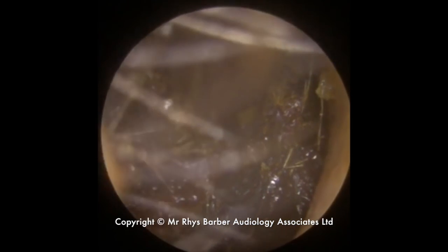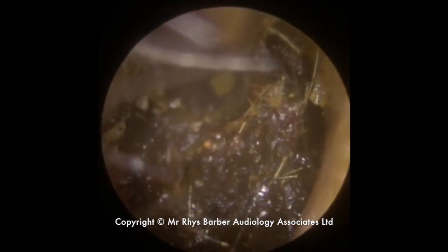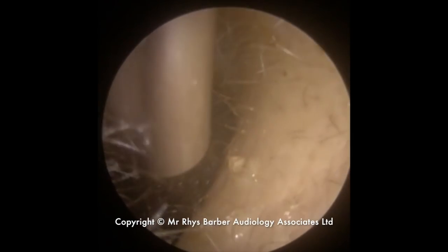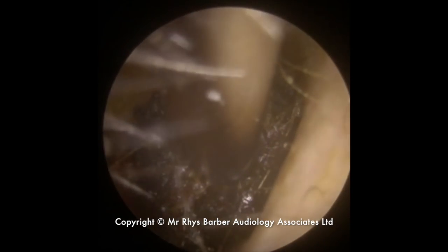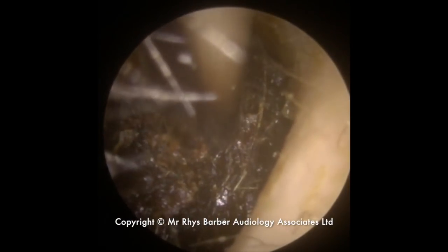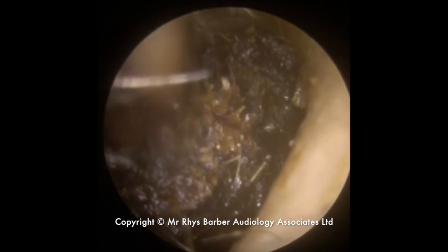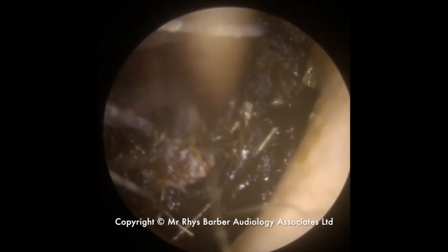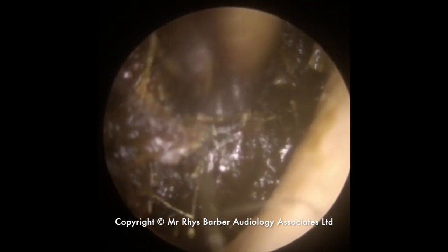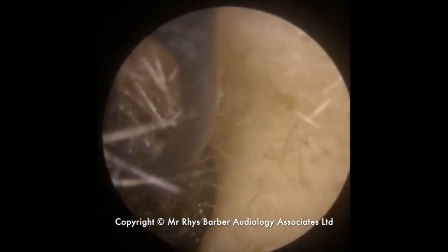You can see the wax lifting away, coming away in slightly bigger pieces now. Just starting to get a little bit of movement — we've unstuck quite a lot of this from the canal wall. Now using the suction of the Zollner to manoeuvre this block towards the entrance to the ear canal.